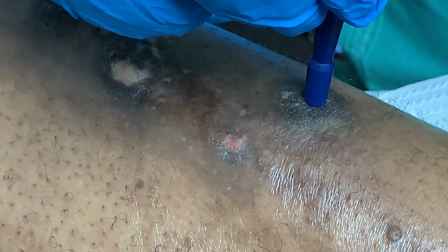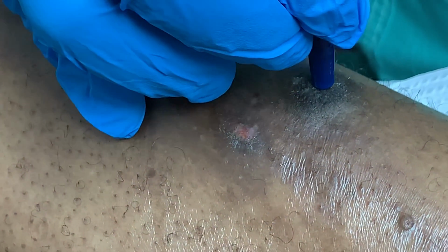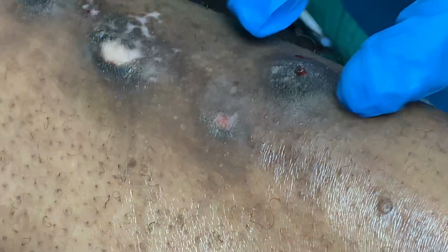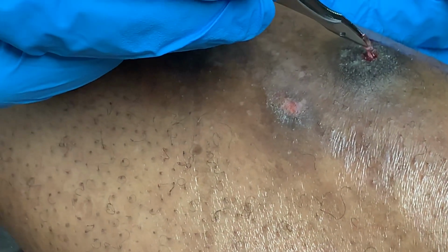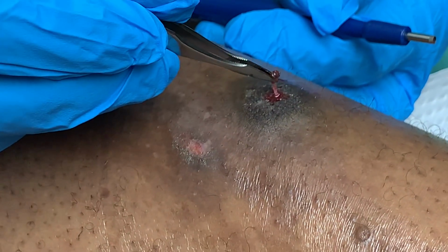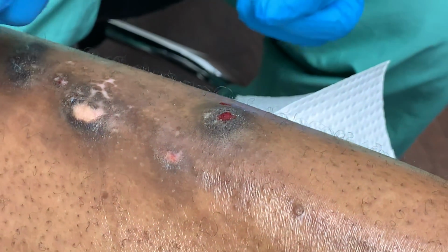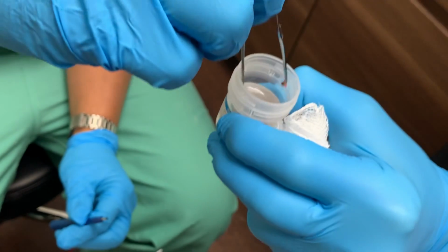And then once we get there, we do that little wiggle motion just like Dr. Ahmed is doing. Then slowly, you push it down again. There we go. He's going to hold it there. And bingo, there it is inside, which is great. We want to always be very careful. And excellent.